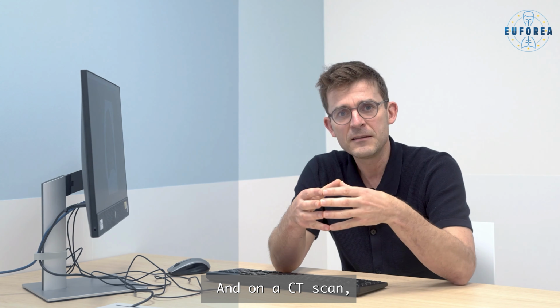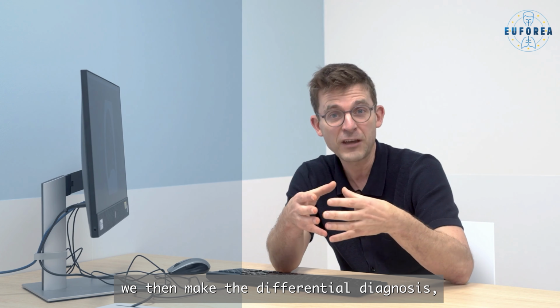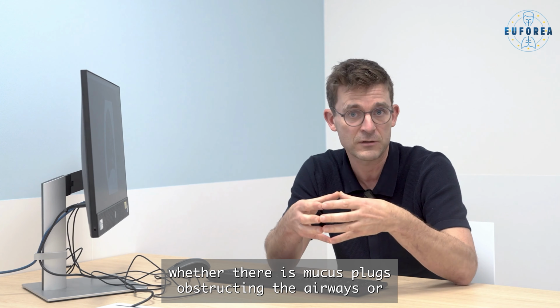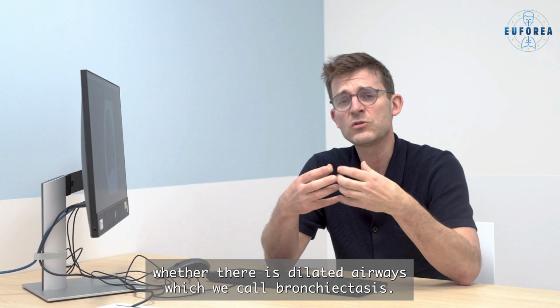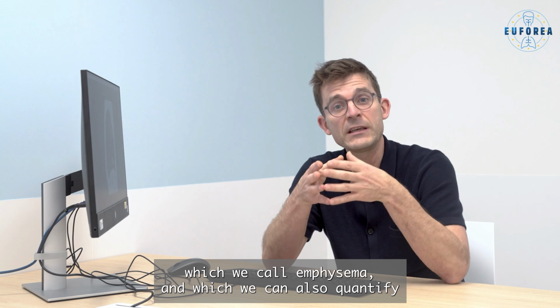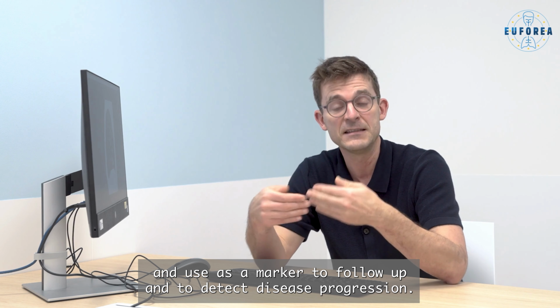And on a CT scan, you can evaluate the airways and the lung tissue itself. With the airways, we make the differential diagnosis, whether this is air trapping, air trapped behind closed airways, whether there are mucus plugs obstructing the airways, or whether there are dilated airways, which we call bronchiectasis. The lung tissue itself is mainly focusing on tissue destruction, which we call emphysema, and which we can also quantify and use as a marker to follow up and to detect disease progression.